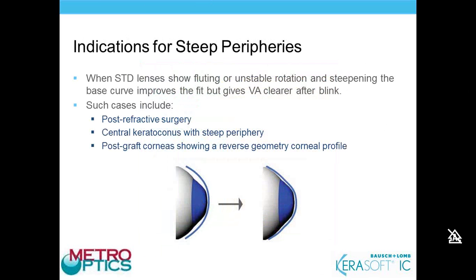But before I would actually go to my fitting set and try another lens, I still want to double check the vision. That's why I don't refine my refractions when I'm assessing this lens. I assess their vision based on the best line that they can achieve with the early over-refraction I do. And this particular lens for this patient would provide stable vision between the blinks. It's just the rest of the steps are not appropriate. And that's why we know that the 8/6 is the right base curve, but for some reason the fit isn't appropriate, so we'd have to try steeper lenses in the set.